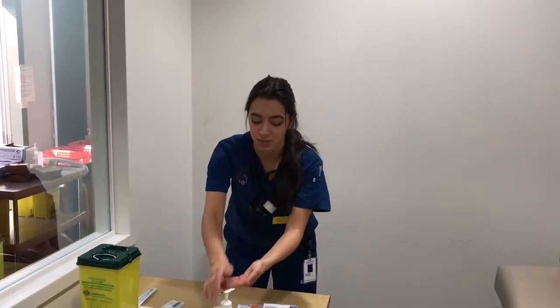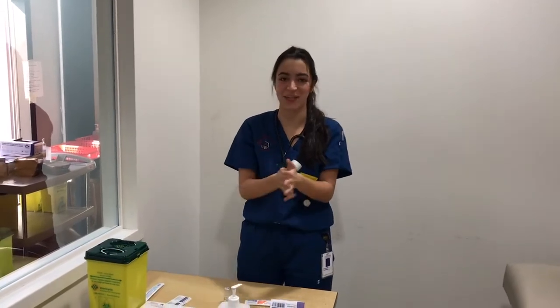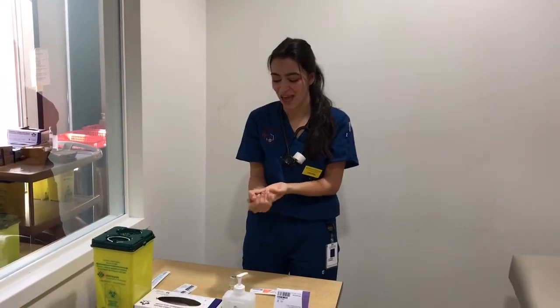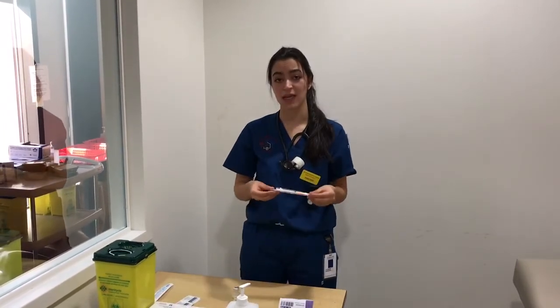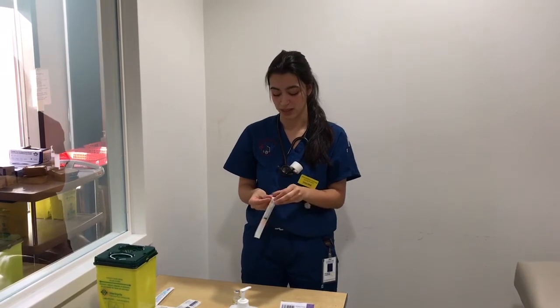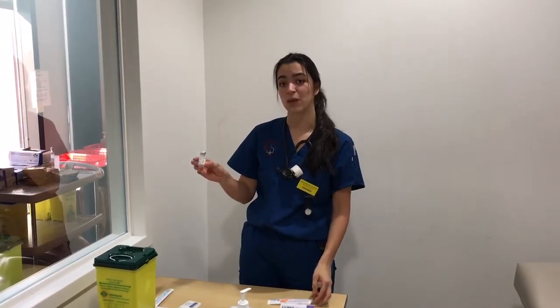Okay, so next up, we're going to perform hand hygiene because it's always important to perform hand hygiene any time you're touching anything to do with the patient or any medication administration. Next, I'm just going to be demonstrating for subcutaneous at the moment, but you want to take the package and make sure that it hasn't been opened previously and it's brand new. And also you want to have your medication with you.